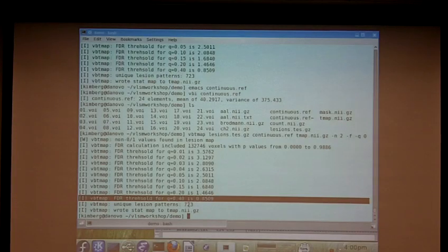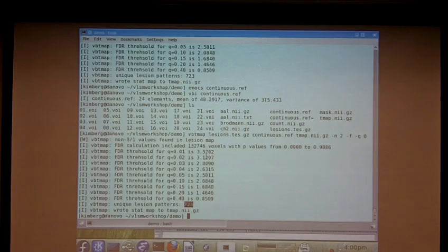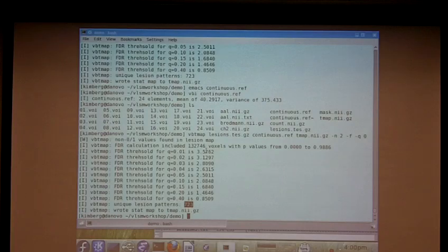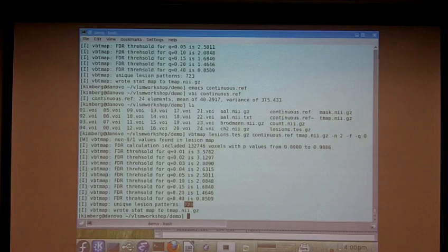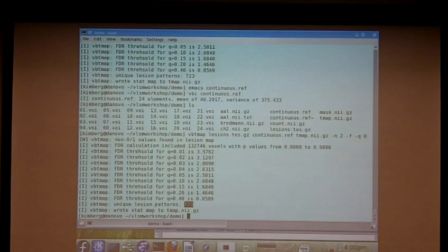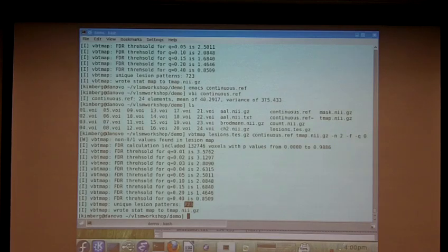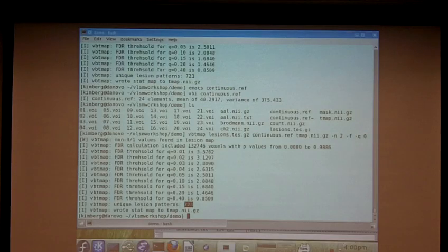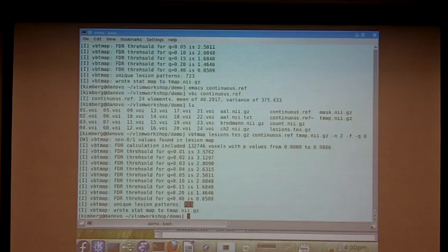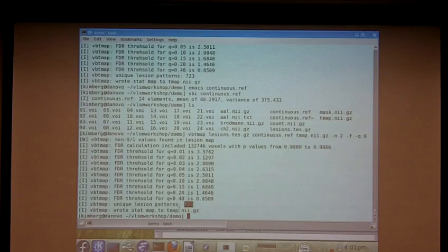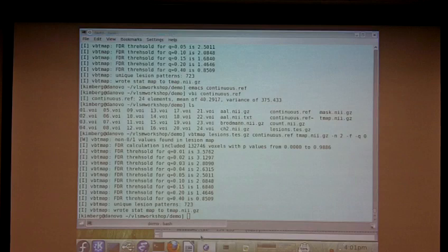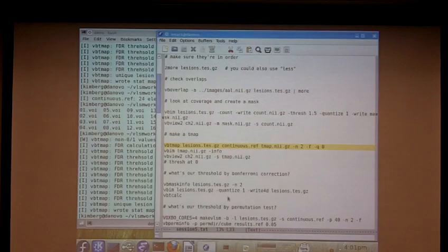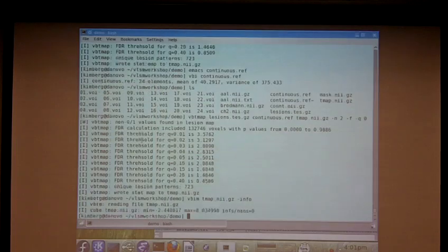The other thing you get out of this is the number of unique lesion patterns. So there were 132, almost 133,000 voxels with at least two lesions in this map, but many of those were parts of chunks, those little chunks that I showed you before where all the voxels in that area are lesioned in the same patients. In fact, there are only 723 unique patterns making up those 132,000 voxels. And the last thing we found out is that that T map that we requested was actually written. So that's good.